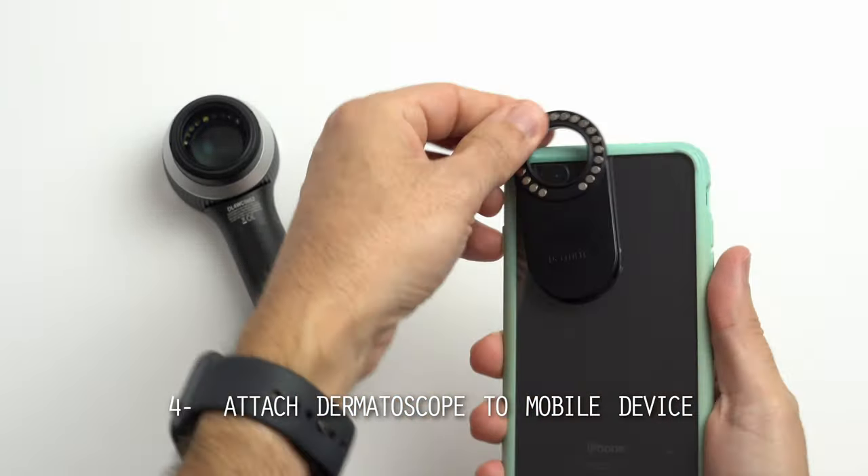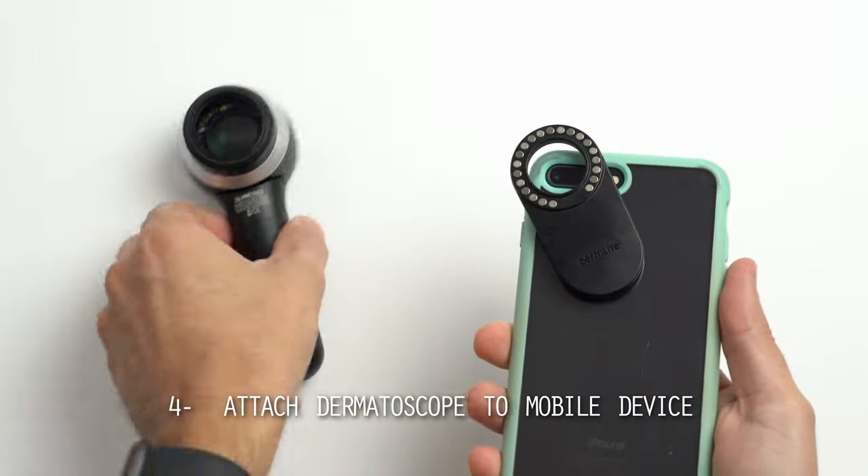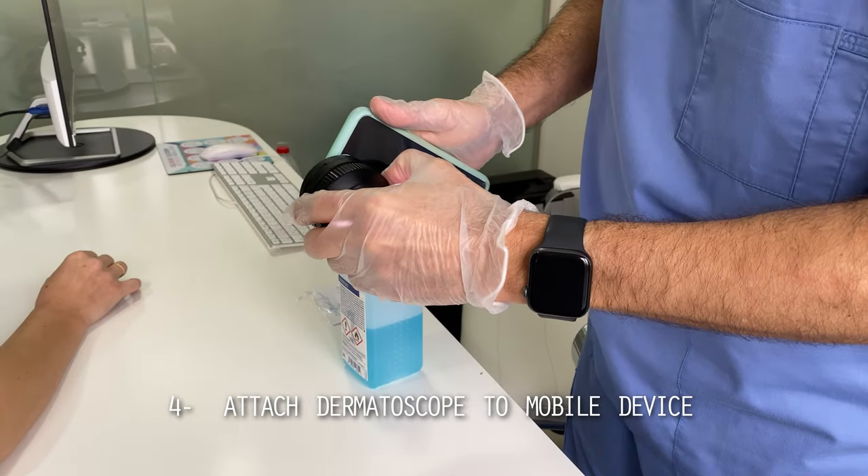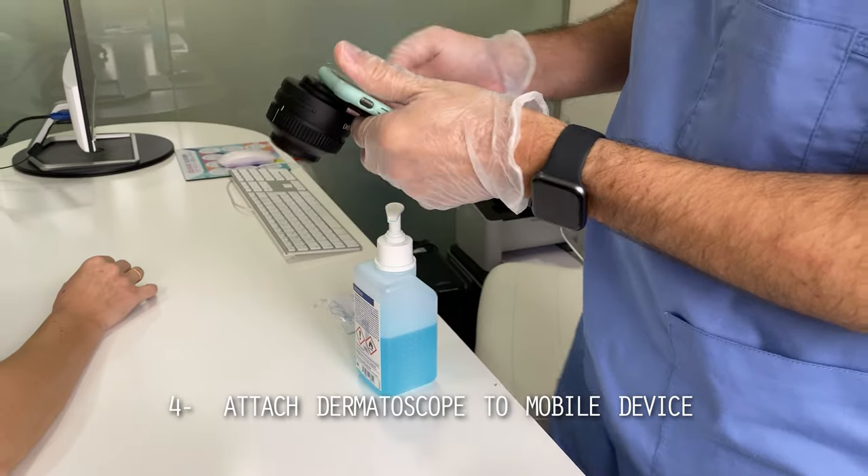The fourth item is also of vital importance. You want to use an adapter that attaches your dermatoscope to the smartphone or tablet and positions the camera in the center of the viewfinder.